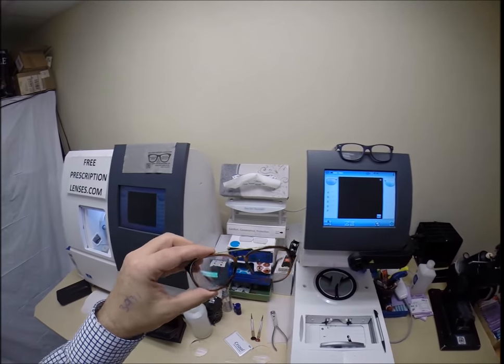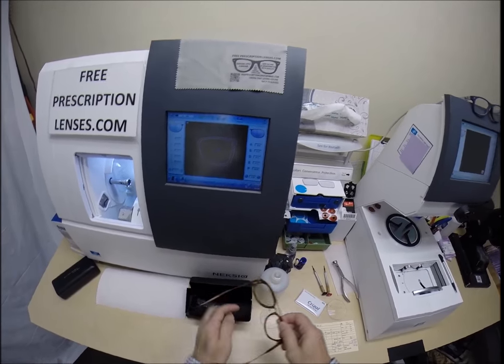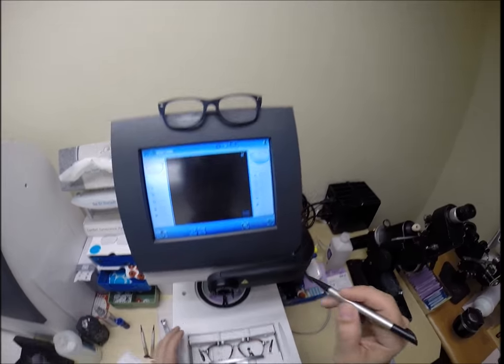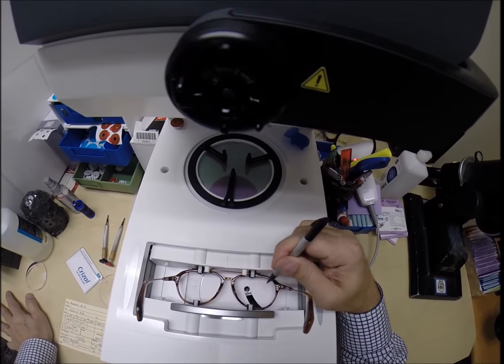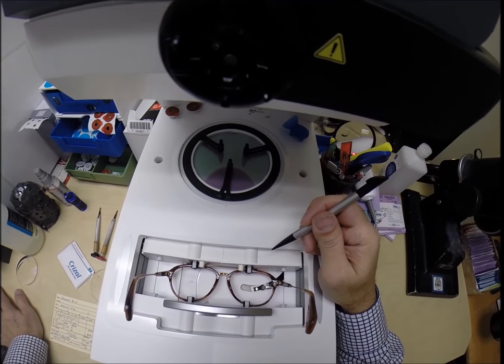I'm going to pop out the original demo lenses, one of which says William Morris on there. Put it into the tracing element of my blocker and hit start. A little stylus is going to pop up and trace the inside bevel of the right side of the frame before doing the same thing on the left.